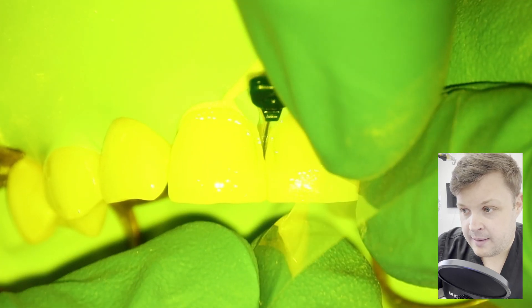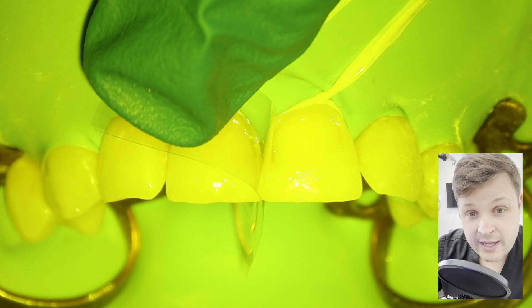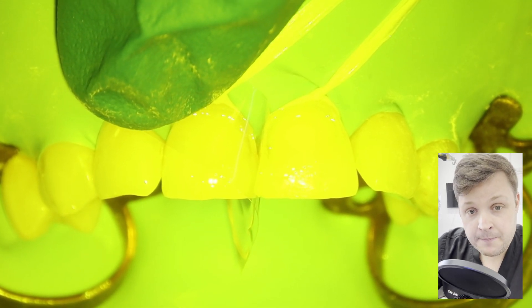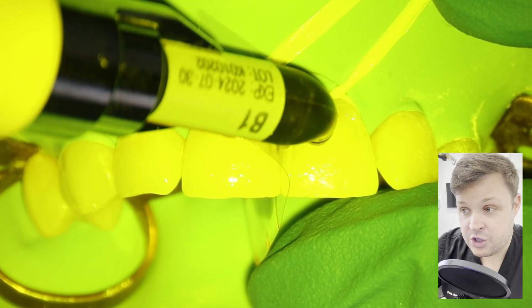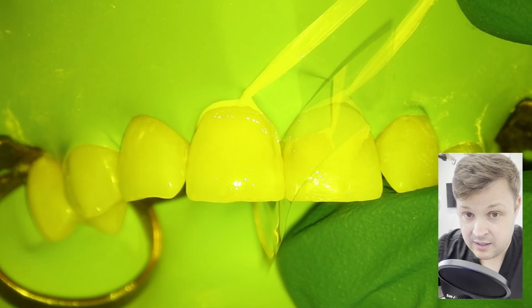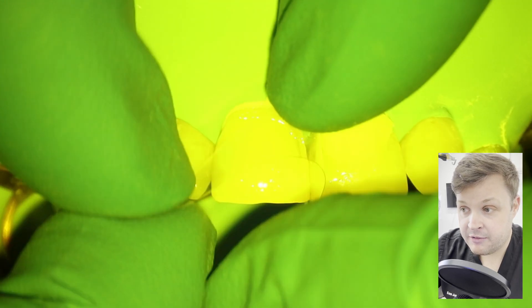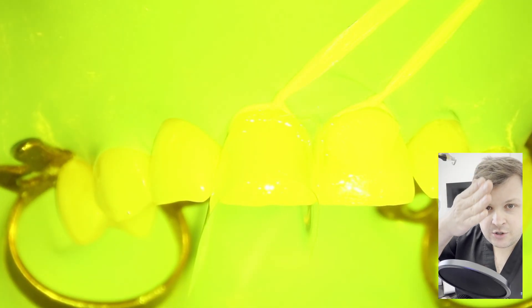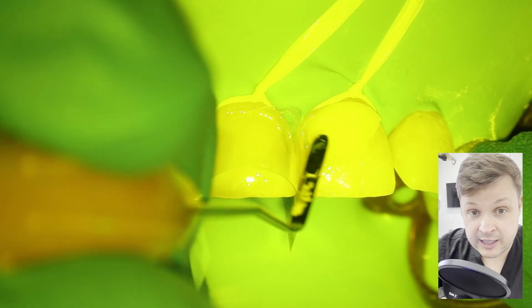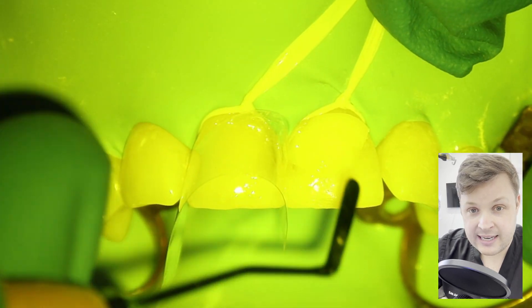The way I'm going to form this tooth today is with a clear strip. To get the clear strip in I had to use a little wedge just to push the two teeth apart. The problem with clear strips is that they sometimes create a flat profile which doesn't always look great. Luckily in this case the cavity is mostly buccal — the mesial aspect of this tooth is intact. If it wasn't intact, it wouldn't create a nice curved edge and it would look unnatural. Because the mesial aspect is still present, I can use that to shape the tooth.